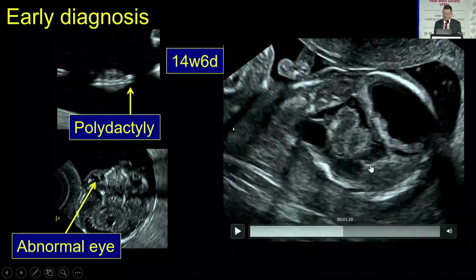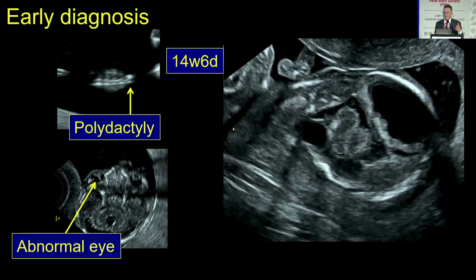You see that the brain parenchyma close to the cortex is hyperechogenic and very irregular, because the neurons went through the glial membrane and are placed inside the meninges, and this is very characteristic of Cobblestone.